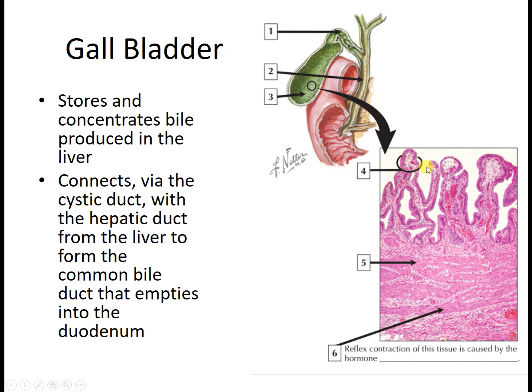Let's talk about the gallbladder. Take a look at the structure of the gallbladder. It resembles something, yeah? Of course, it resembles the small intestine, but it doesn't contain crypts of Lieberkühn. It doesn't contain lacteals. We have some villi, so it's like a poor small intestine. It requires not such excessive absorption or moisturizing, so the number of goblet cells is very decreased. We have no lacteals because fats are not absorbed here.